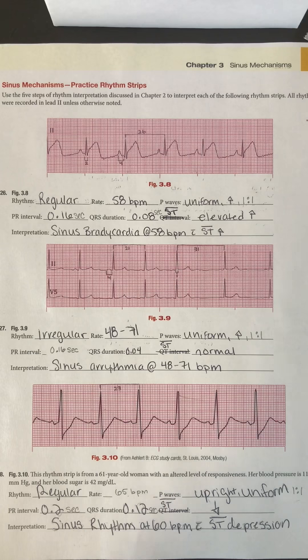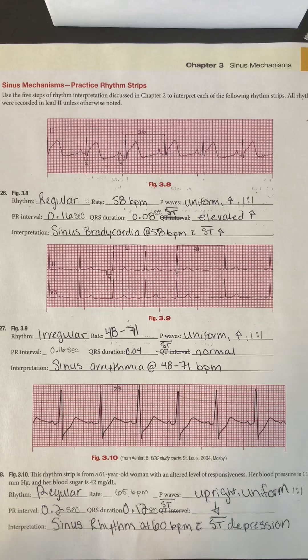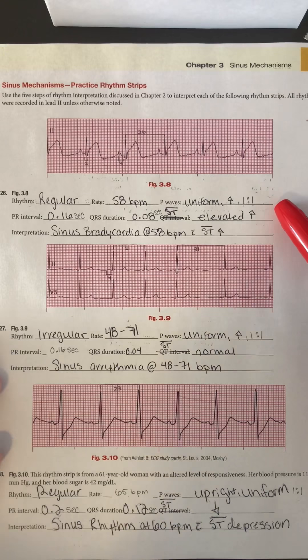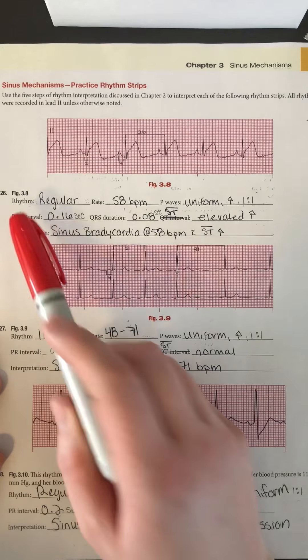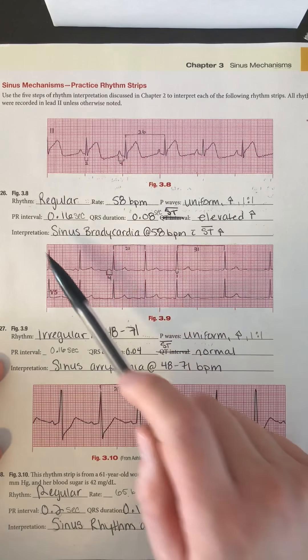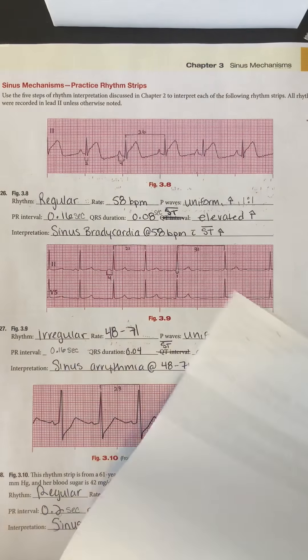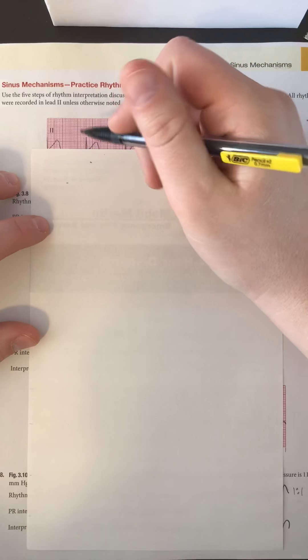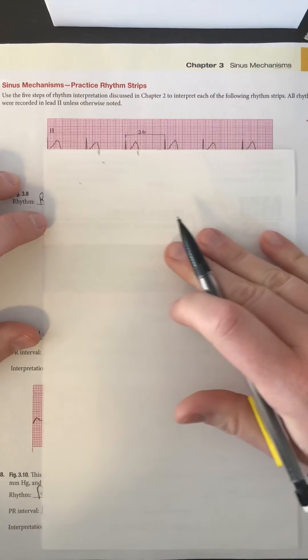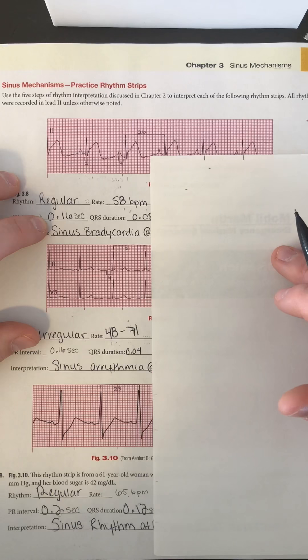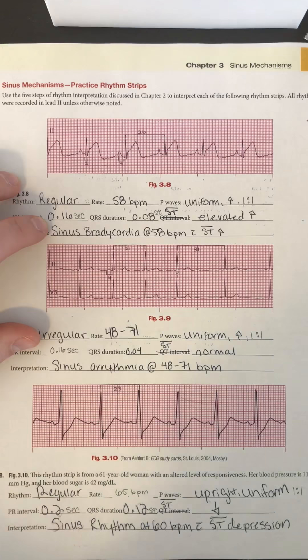For this video we're going over some of the practice rhythm strips in chapter three of the ECG Made Easy book, sixth edition. This is over sinus mechanisms. We won't be covering all the strips due to time. Looking at the first practice strip, number 26 or figure 3.8 — first thing we want to look at is regularity. Looking at this rhythm, it looks to be pretty regular, and we can use this method to see that the QRS complexes appear pretty regularly.